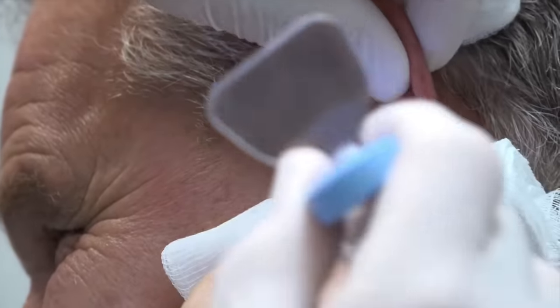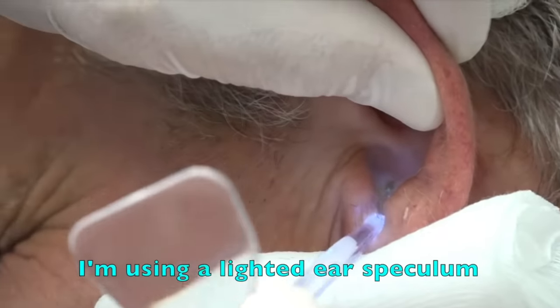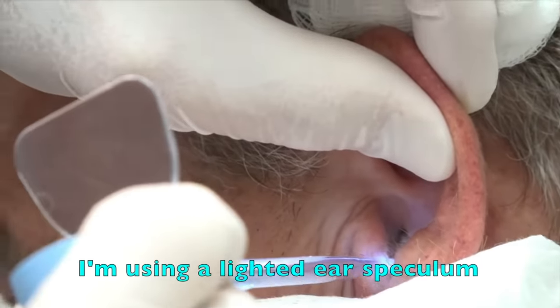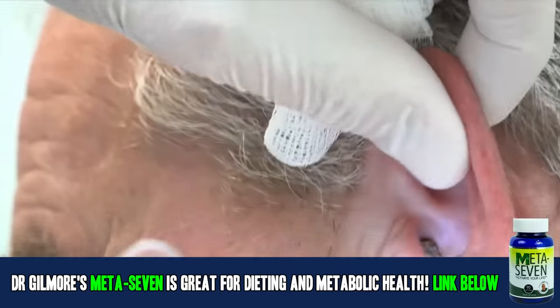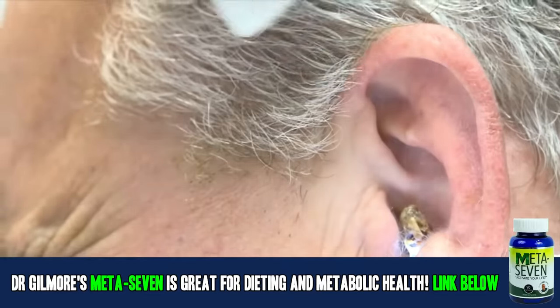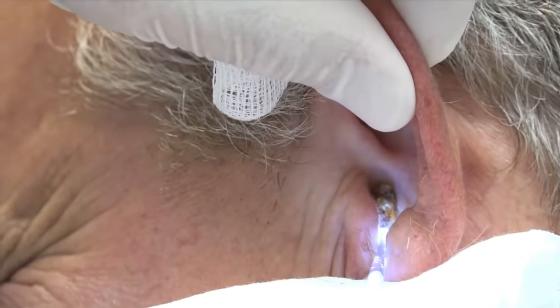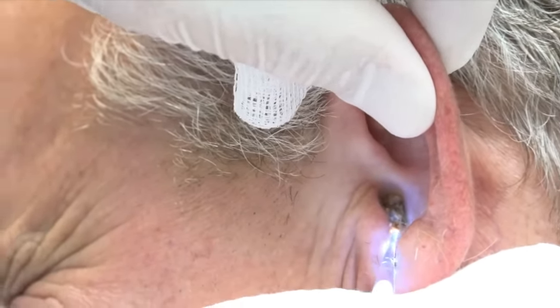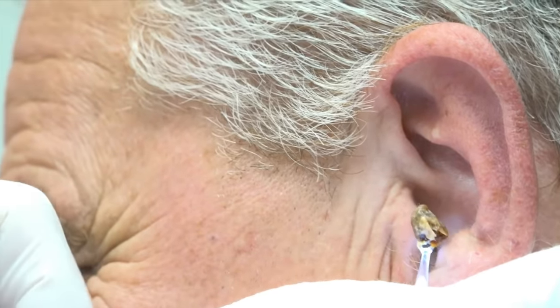So we're going to take a look in here again and see if we can't do this for you. Is that hurting any? Well, I can feel it. I'm hearing a little popping. We've got a little piece right there. You've got a big chunk coming out right here, my friend. Looks like a monstrous collection of cerumen right there. And let's see that again in slow-mo — here we go. Speculum's in, light it, something's coming out. An enormous, monstrous collection of cerumen making its way out of the ear canal.